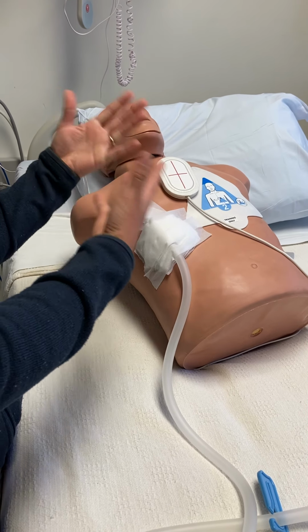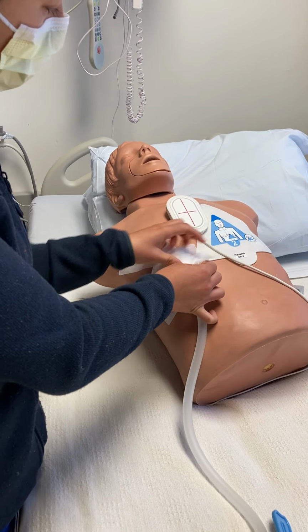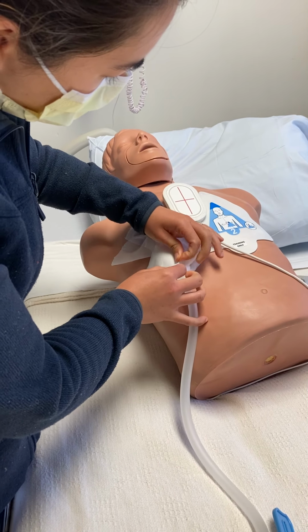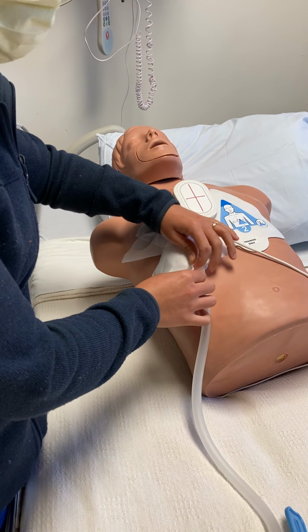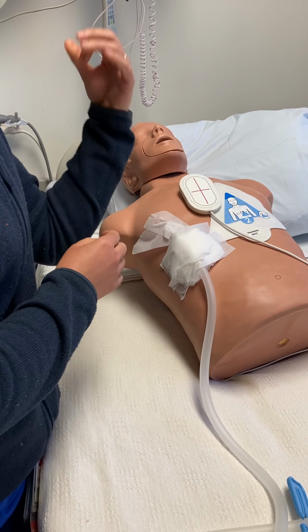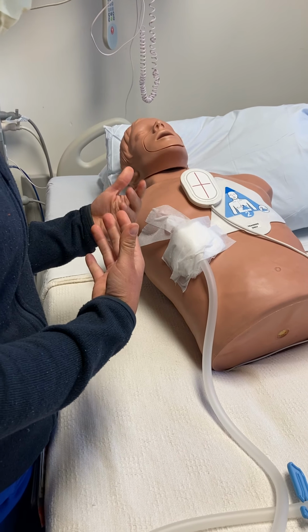Now, let's say that we don't see anything there. You're definitely going to want to take this back and also look a little bit further up and see, do you notice a drainage hole? You can also look at your chest x-ray where we talked about that radio-opaque line and see where the last hole is and if it's still inside the chest.